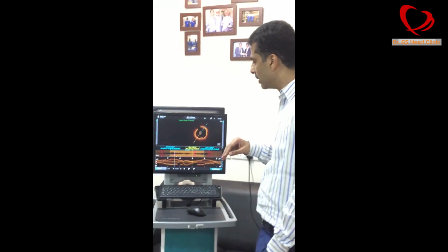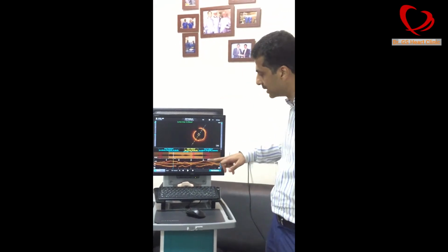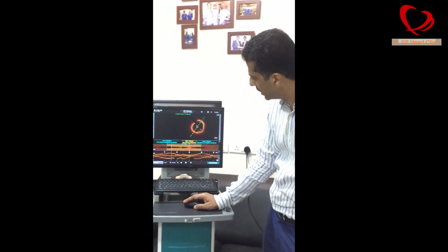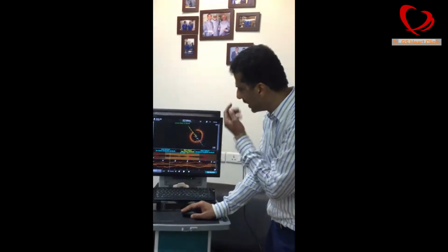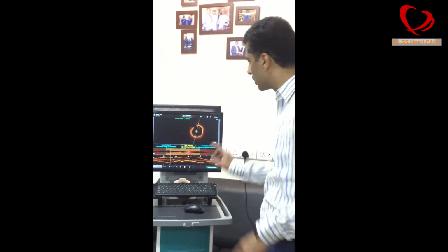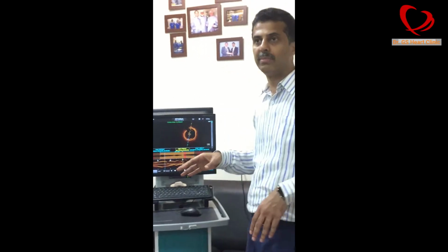Okay. So it definitely low. The advantage of this one is you can rotate it. For example, if I move the area, I can see three-dimensional. See this? As I am moving, I can see the entire three-dimensional view of this. So the entire artery, I can look at it as it's moving. And second, with one injection, it automatically gives measurements of every area. It gives you automatic measurements.